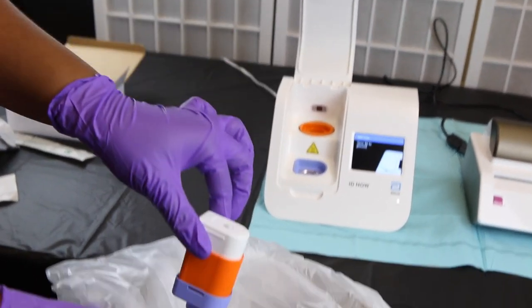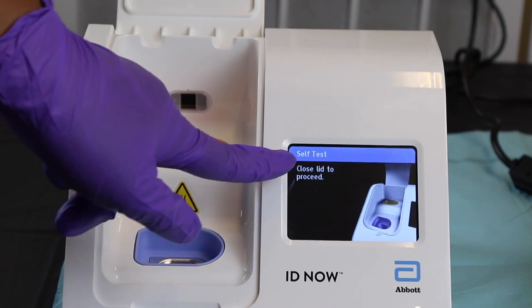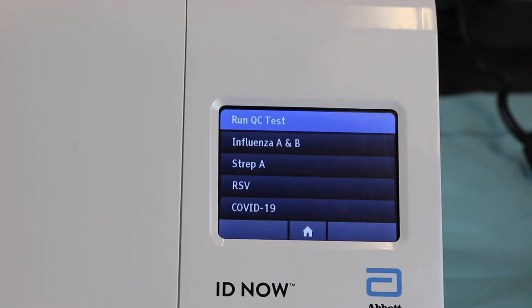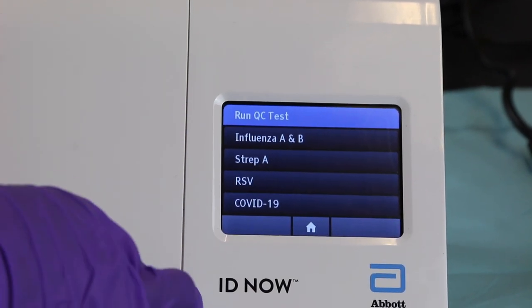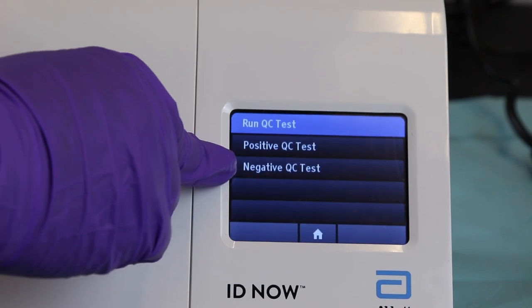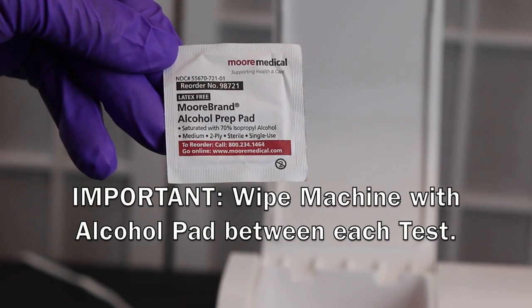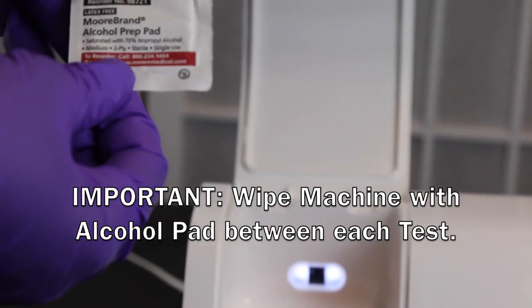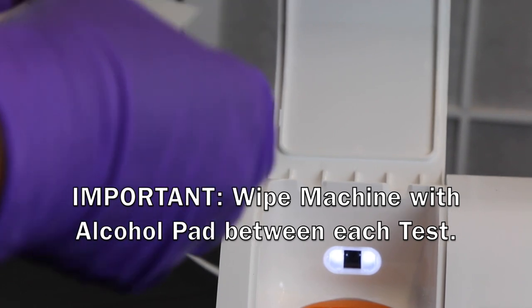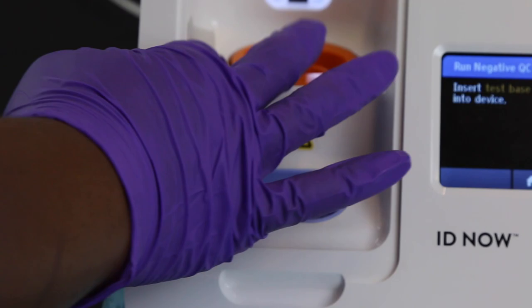This is not a biohazardous material. Follow the prompts and close the lid. The machine will run a 40-second self-test and then you're ready to repeat the same steps for the next QC. Proceed to the other QC test and repeat the process. Wipe down the machine with a 70% isopropyl alcohol swab, making sure to avoid the wells. Now you're ready for the next test.